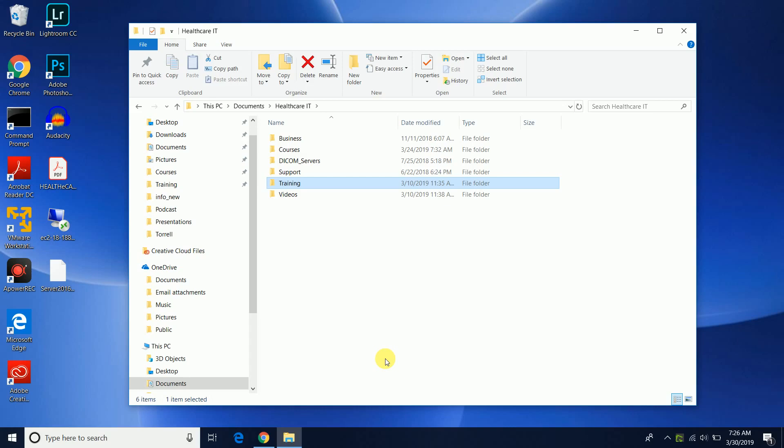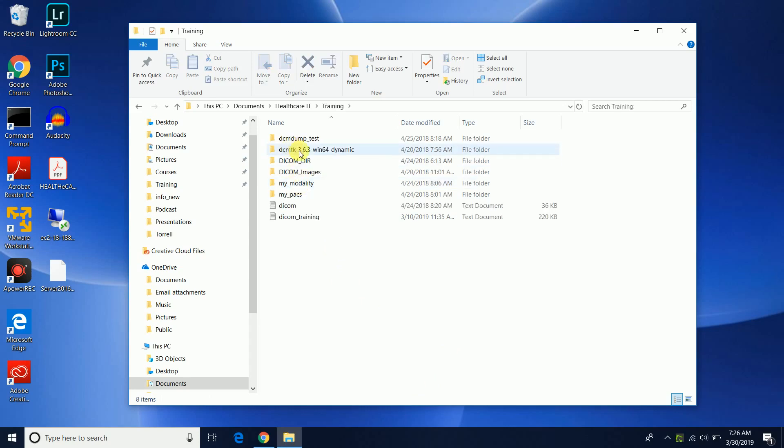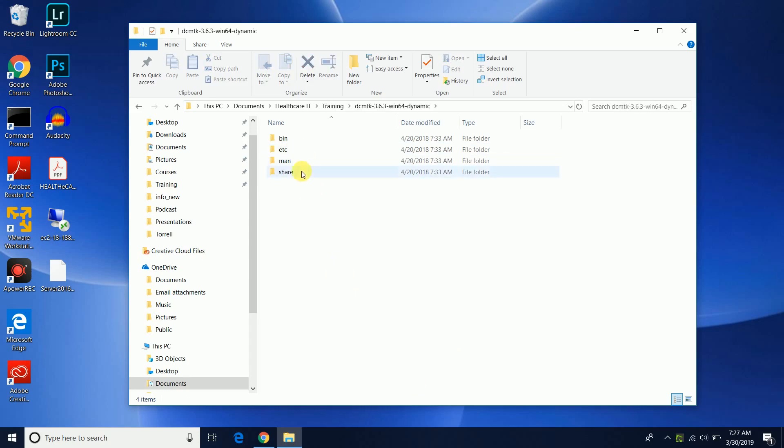So let's go ahead and get started. I actually already have the DICOM toolkit installed and if you don't have it installed already, I will link to a video that talks about how to install your DICOM toolkit.